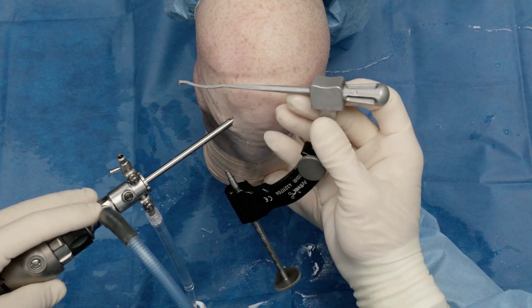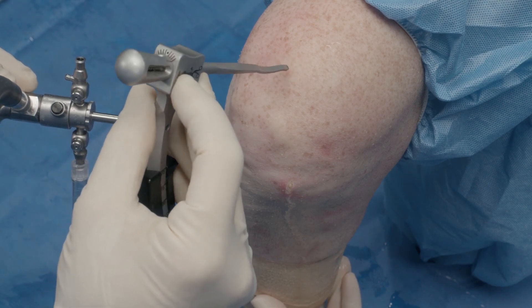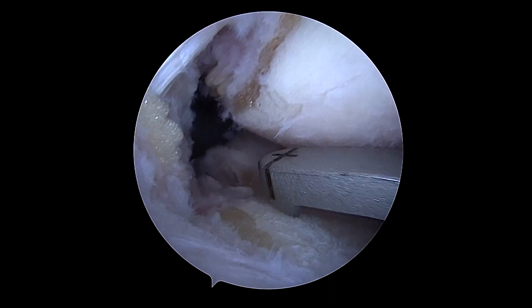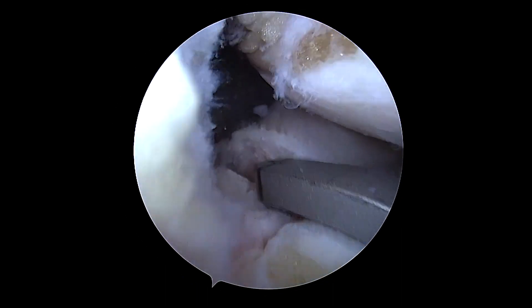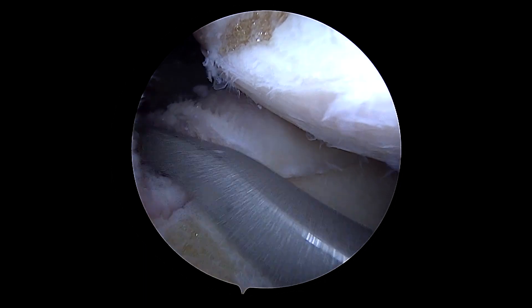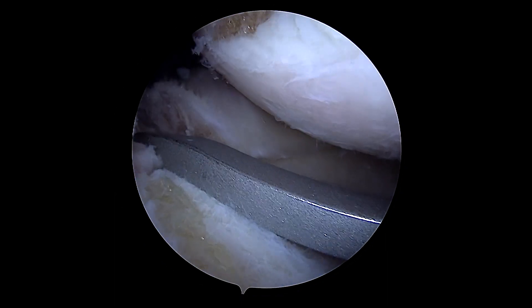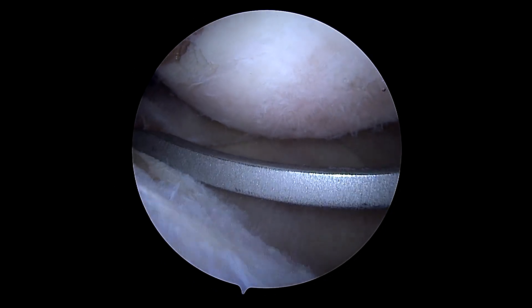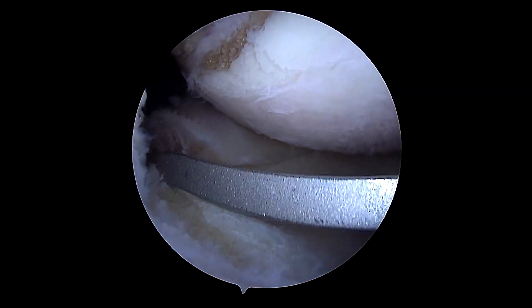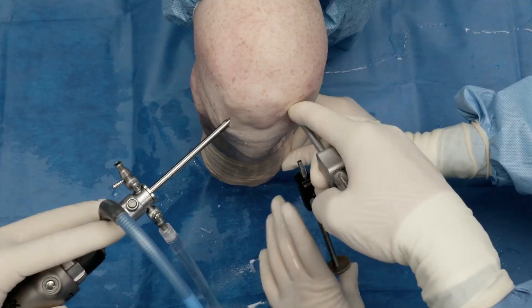We're going to introduce the point-to-point transtibial root guide. For this right knee we're going to go from the medial portal to the anteromedial face of the tibia. I've actually rotated this 40 degrees to the right and I'll show you when we introduce this into the knee what happens with that. That laser line really helps visualization — you can see our point and the anatomic remnant, exactly where we want this root to be. With the point we simply find our spot, and you can see how removing a little bit of that tibial spine lets the guide sit nice and flat. With the ability to rotate, we can really achieve our target on the anteromedial face of the tibia without creating torque.